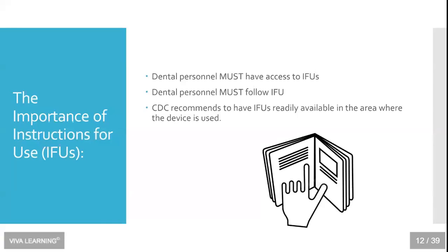But this question is so important. Brooke said she's seen some pushback from dentists regarding CDC recommendations. They say, well, those are just recommendations and not requirements, and we don't have to follow those rules. Is this true? What is the good response to this? The good response is, number one, if you are within the United States and practicing in the USA, check your state dental boards.